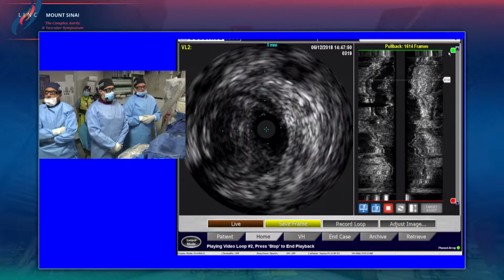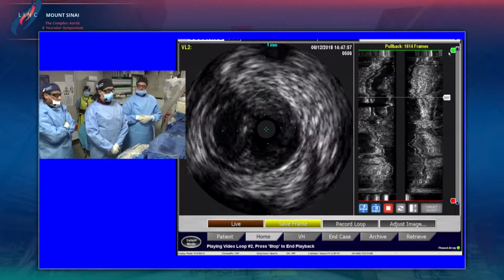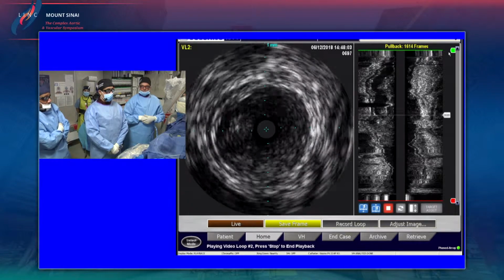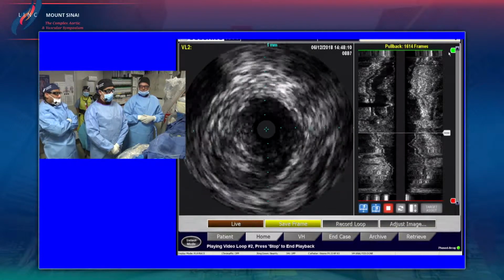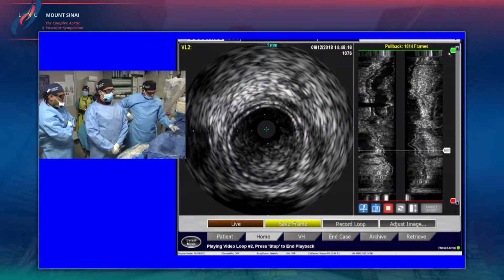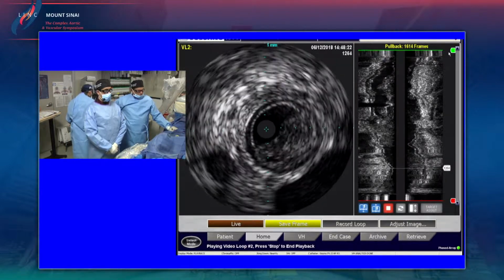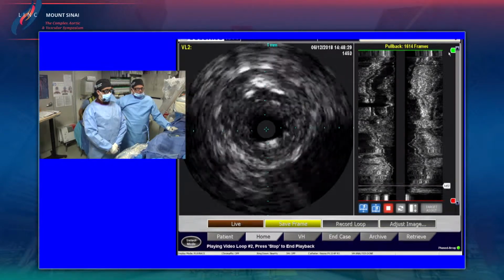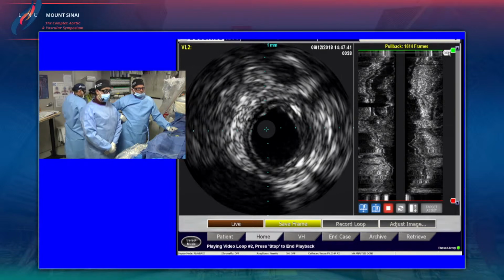Hello, PK. This is Jos. I think you're still dealing with a mixed kind of plaque here. There might be some more organized thrombus, so the risk of dilating at this point is probably still high. I think I would have preferred in my institution to start with lysis or go directly with a debulking technique, either laser or JetStream. Right? Yeah. And why not predilate with a small, short balloon, just PTA? Yeah. I think the risk of distal embolization is pretty high in this case. He has a filter inside. But looking at the IVUS, I think there are still some areas that might be prone to distal embolization.